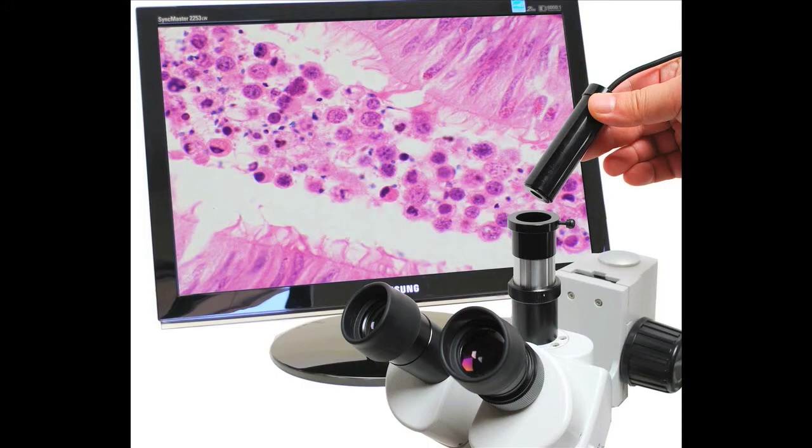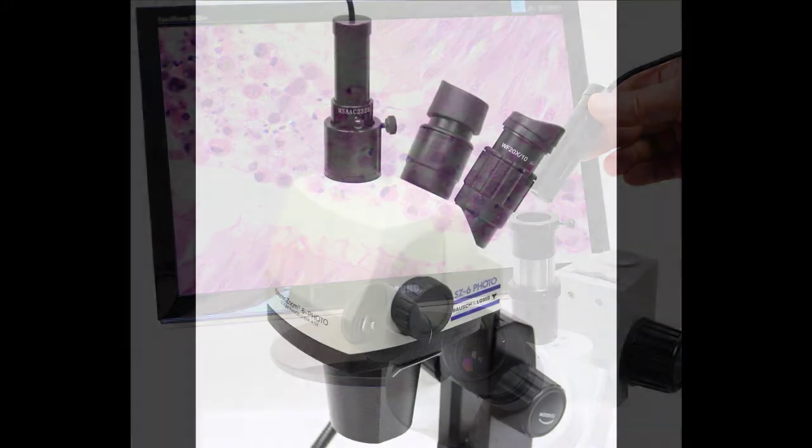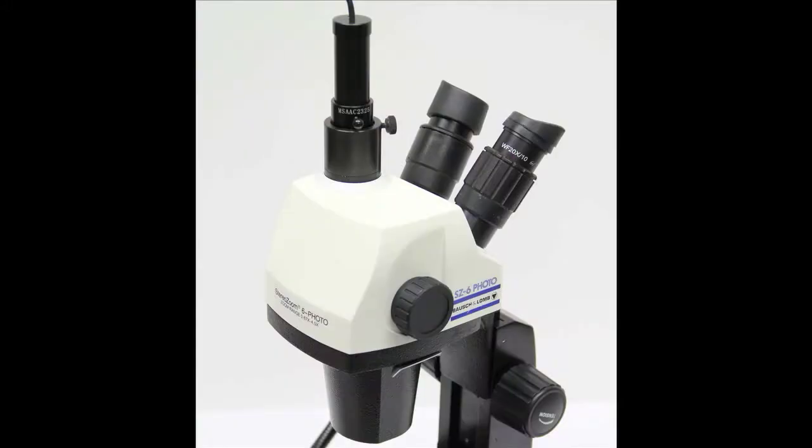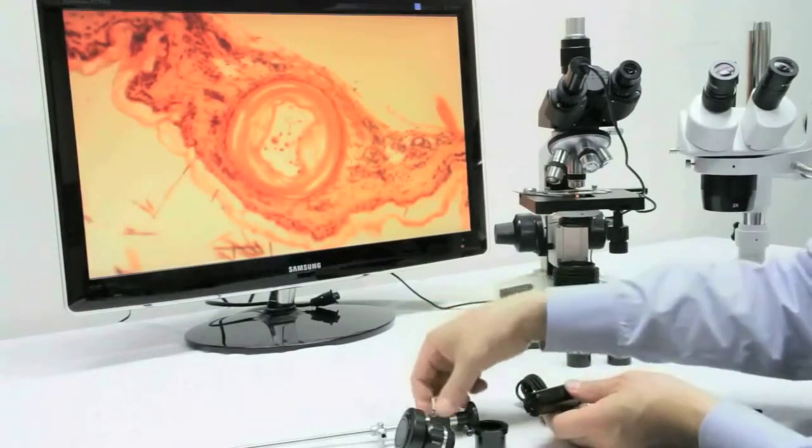The AM422XN can fit directly into a C-mount or trinocular slot if the slot is 23mm. You can also connect to a rigid scope or flexible scope by simply connecting to a coupler.